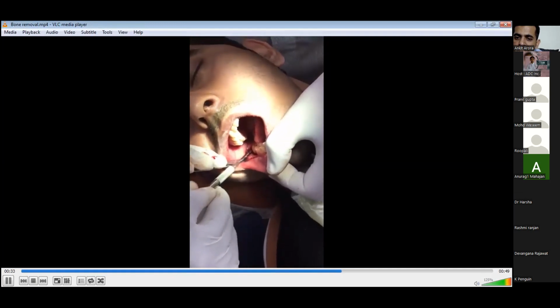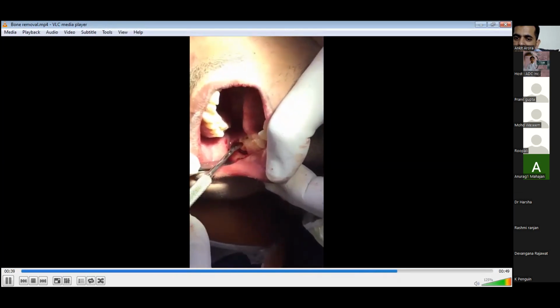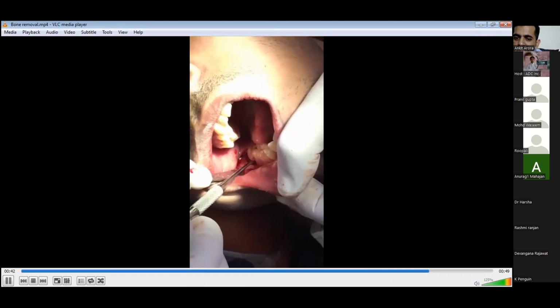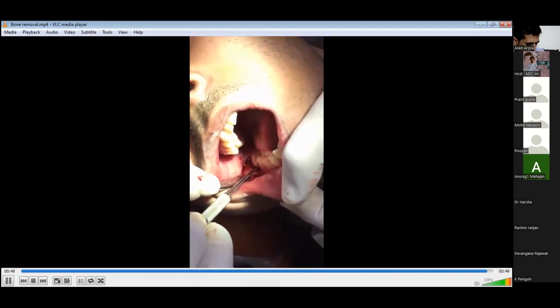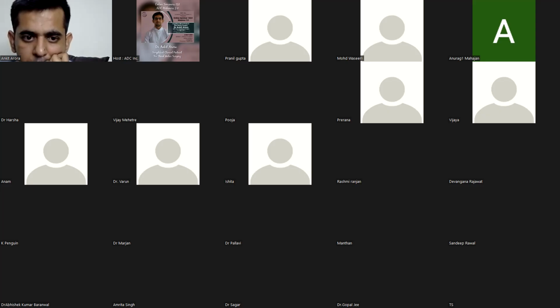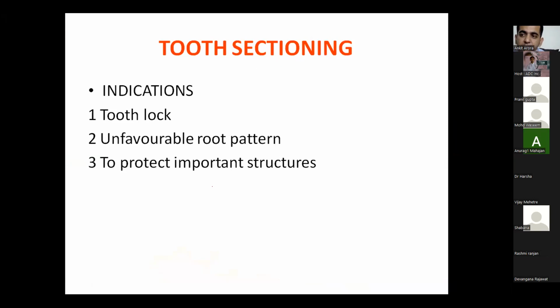And as we progress to the distal end, it goes to the most distal point of the distal lingual bone of the third molar. So we are here with our impacted third molar, lying in the bone, and we have removed the bone, and this is the fulcrum point where we have to remove the tooth. Okay. So when we have removed the bone, we know that it is easy to go ahead with our impaction, and we can remove it.